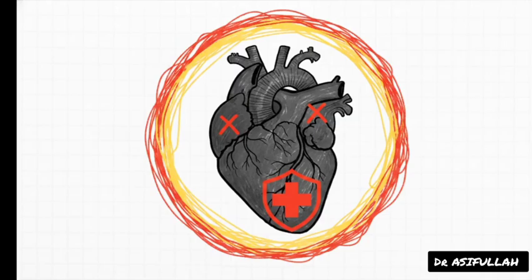And we really have to highlight this specific trifecta: a new right bundle branch block, plus a left anterior fascicular block, plus an anterior MI. If you see this pattern, you are looking at a catastrophic indicator. This points to massive, extensive septal necrosis involving the proximal His-Purkinje system, likely due to a proximal LAD occlusion. It carries a staggeringly high mortality rate, poses a massive risk for refractory shock, and absolutely mandates high-intensity coronary care unit admission with prophylactic temporary pacing and urgent electrophysiology intervention.